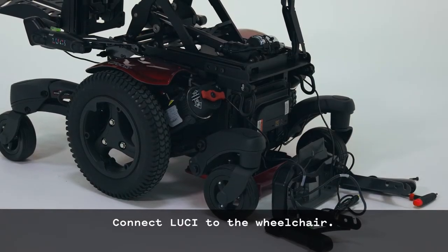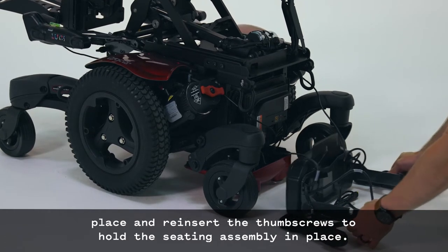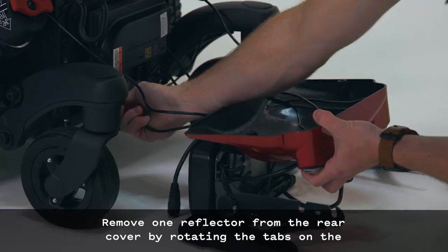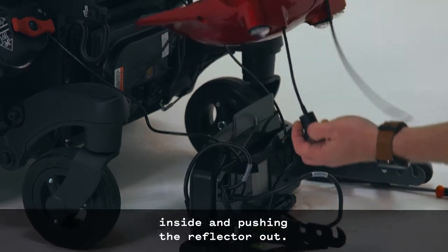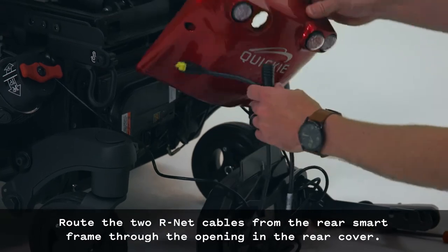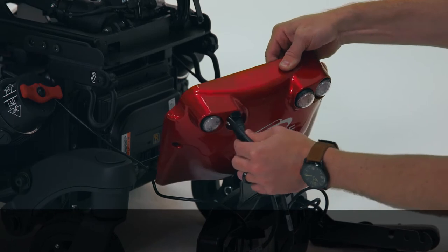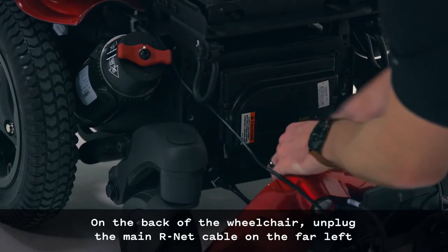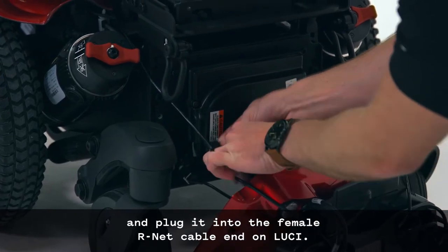Connect Lucy to the wheelchair. If the battery compartment was opened, flip the seating assembly back into place and reinsert the thumb screws to hold the seating assembly in place. Remove one reflector from the rear cover by rotating the tabs on the inside and pushing the reflector out. Route the two R-Net cables from the rear smart frame through the opening in the rear cover.